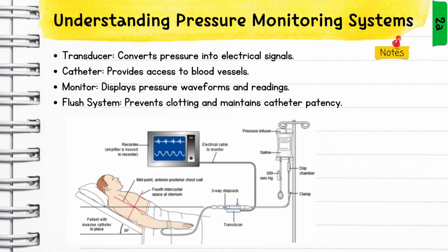Think of that as a valve, like it lets fluids flow, or you can stop it. The transducer is the thing that has the electrodes that's actually measuring something inside the tube. So you see the transducer is kind of halfway there, right? The catheter, remember, same thing, kind of like a lumen. It's the plastic tube that goes into the blood vessels or into the body.